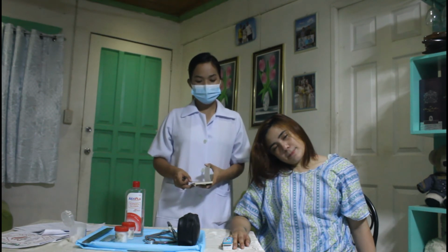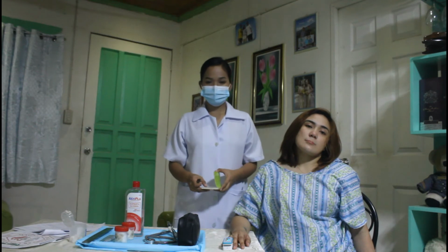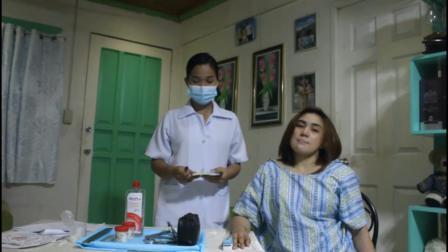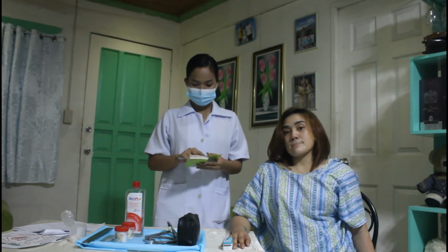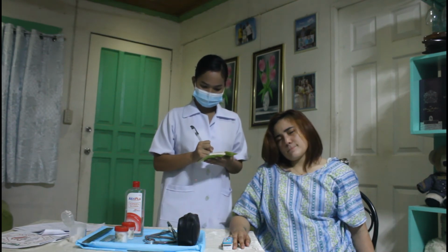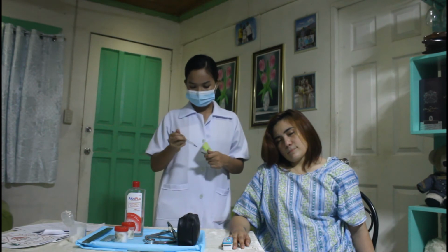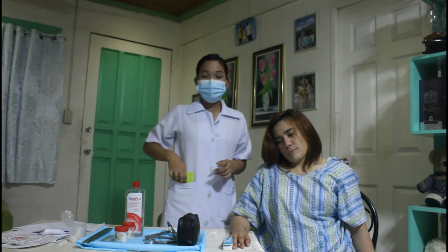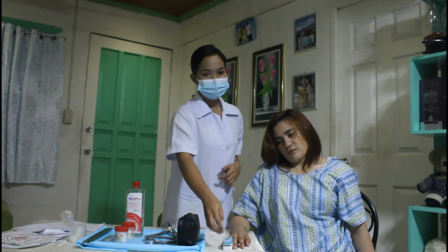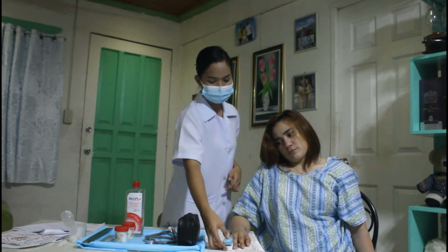So once it's done, then read the SpO2 on the digital display, and then of course take note of that. So remove the probe and turn oximeter power off.